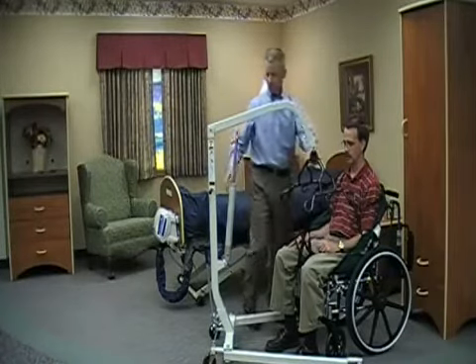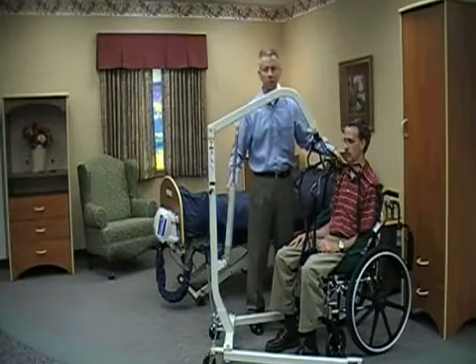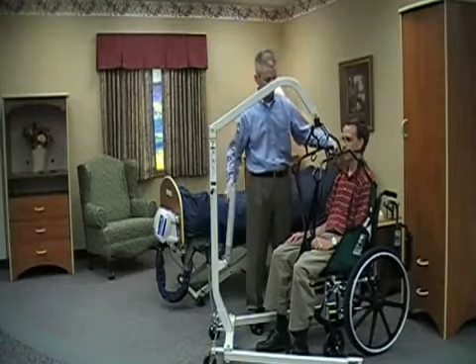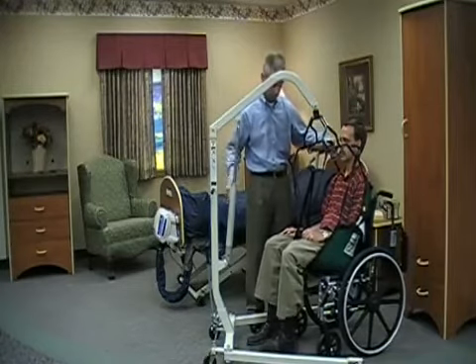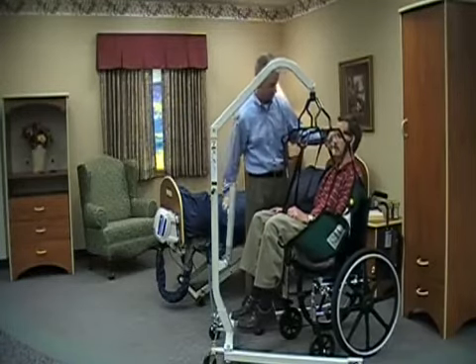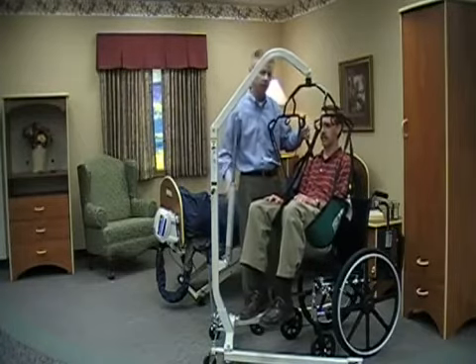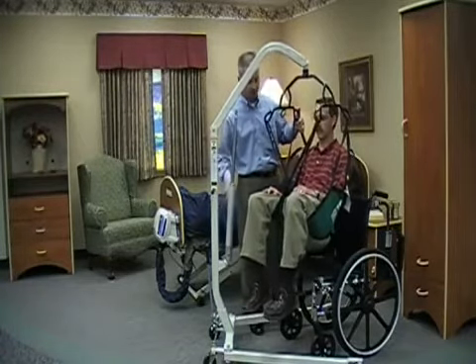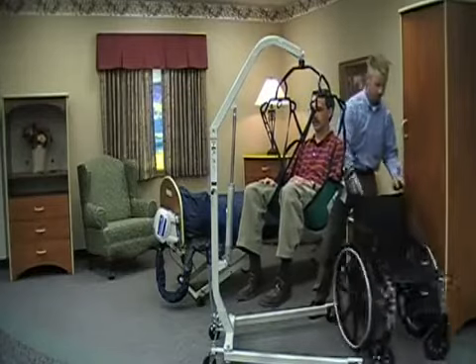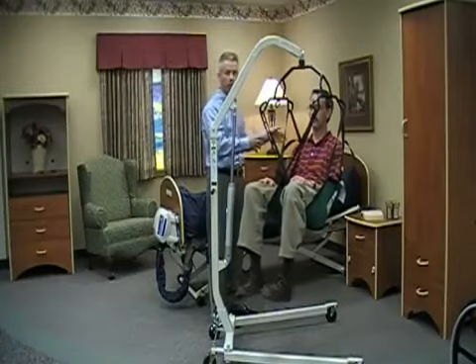After having made my connections, I can simply operate the lift. I'm going to make sure that I've got an idea of where the resident is at all times, and continue to make my lift until I've lifted them free of the chair. After having freed them of the wheelchair, I can position them however needed, pivoting them so that we can transfer to a bed. We can remove the wheelchair, and then complete our transfer by simply wheeling them to the bed, positioning them, and lowering them down.